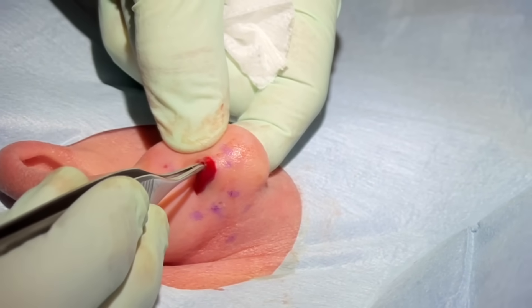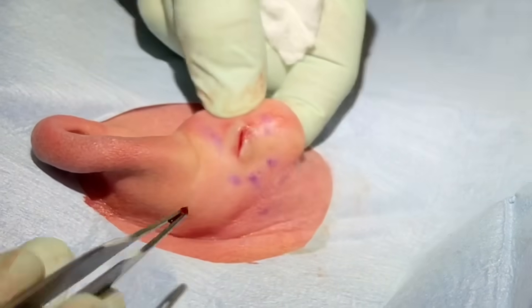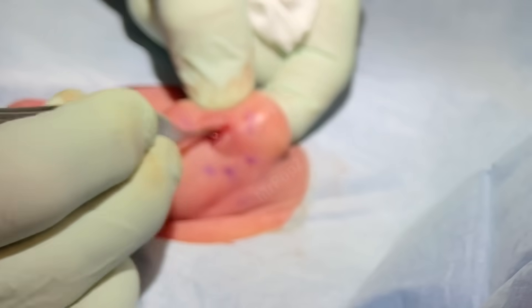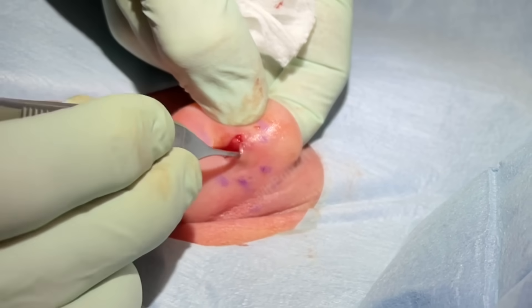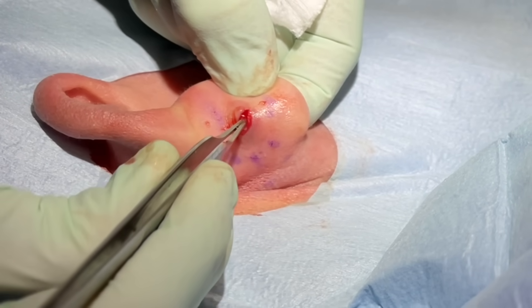You'll feel that today. Those white bits are just cysts, kind of the wall dissolving there.